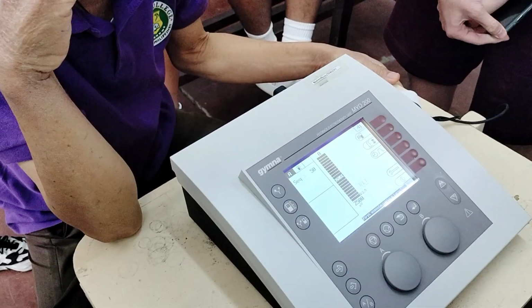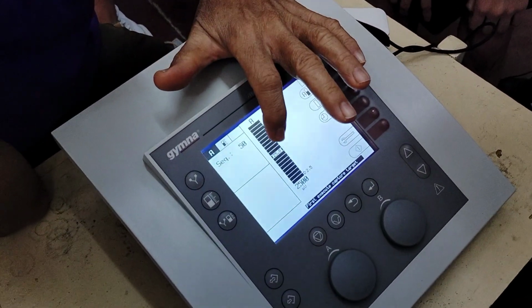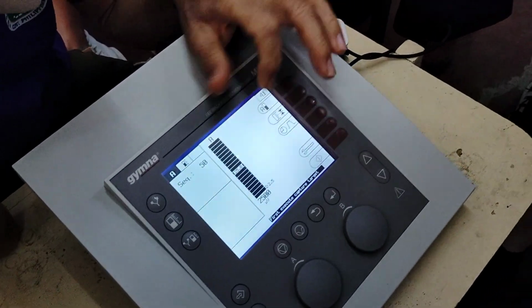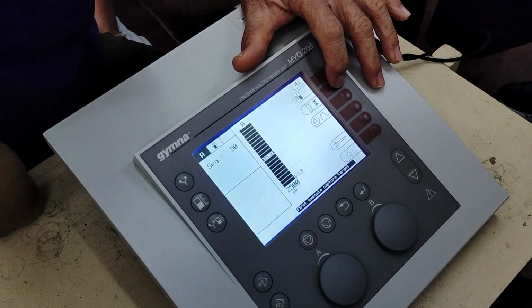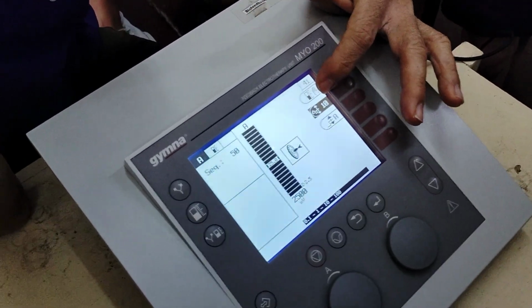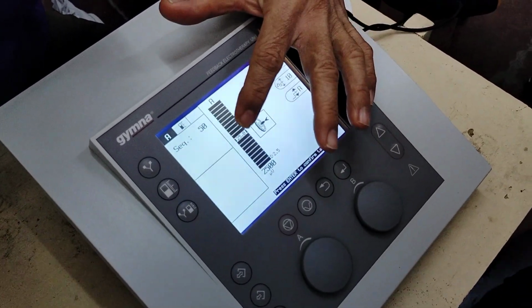Okay, so how do we further adjust this? Let's say you have channel A. The next thing is to adjust the threshold level. At the moment, this is 25 microvolts. To adjust it, you press this, and you can see the increments, the gap of each increase. You have it by 10, so if you set it by 10, the change will be by 10.